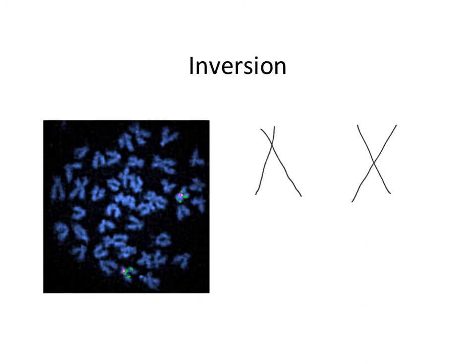So this chromosome in the lower half of the panel is the one that I'm going to designate chromosome A. So I'm going to call that chromosome A, and I'm going to call this one chromosome B. And we can already tell that they're a little bit different, because despite having the 2 FISH signals, which suggests that these are homologous chromosomes, they have different shapes. Chromosome A looks submetacentric. Chromosome B looks metacentric. In this case, the white dots that I've drawn on this panel represent the location of the centromere.